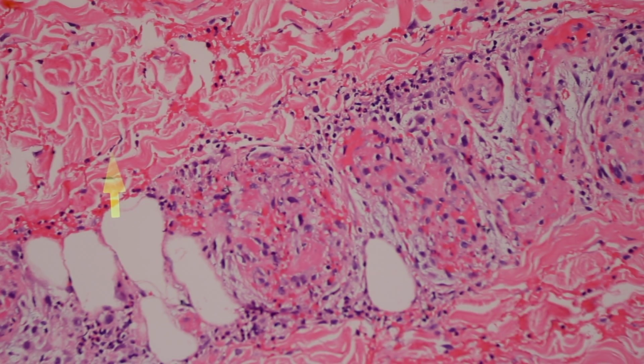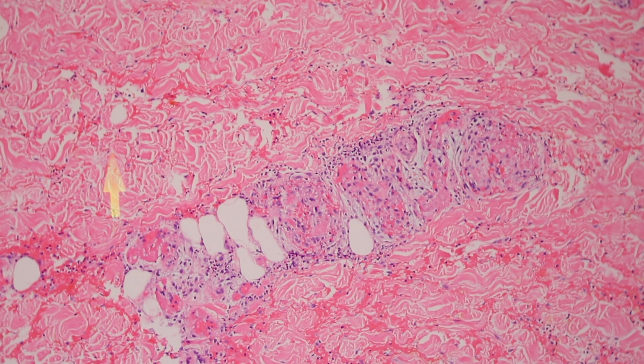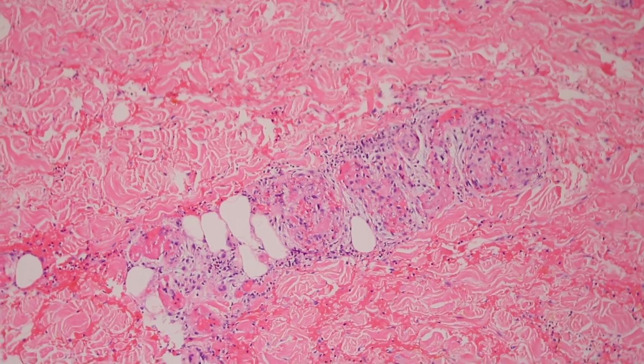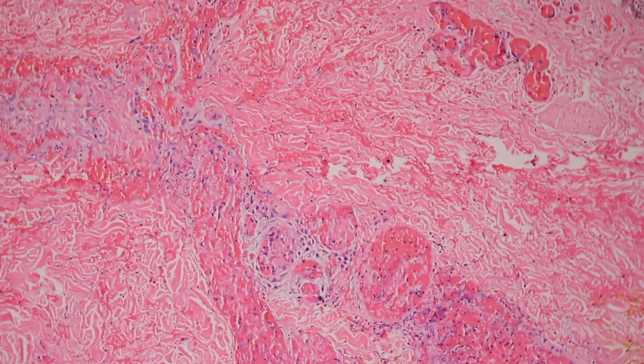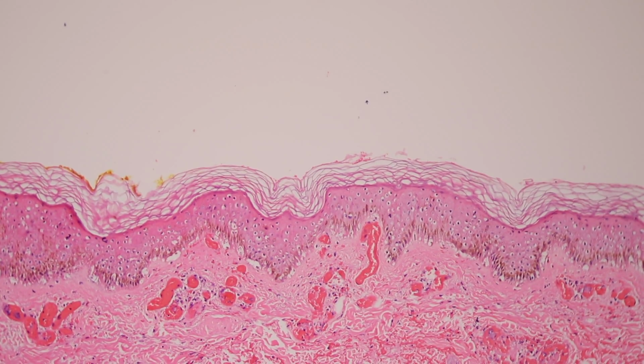When we see this setting, we have to think again about systemic vasculitides, and particularly some of the ANCA-associated vasculitis. You can see this finding, but in this case, there was a distinct clinical feature. These areas were bullous, or almost bullous forming, and they were very purpuric, and they were on the ears, just the ears.